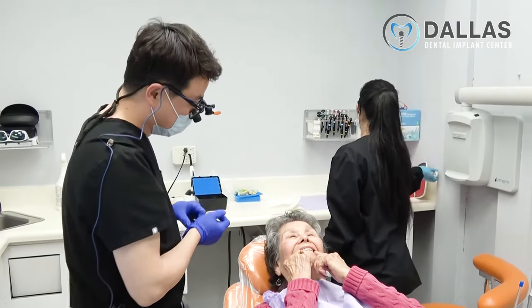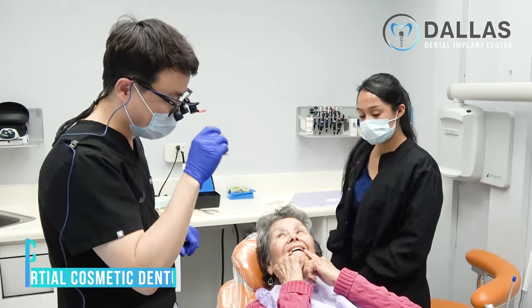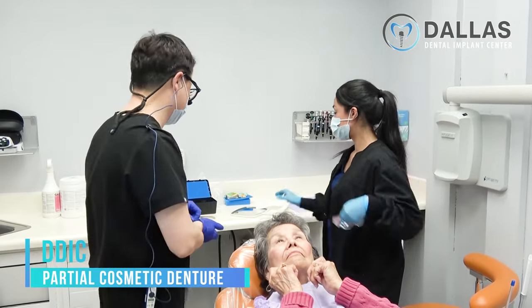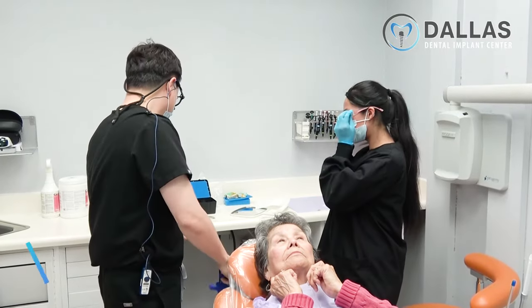Okay. Are you ready? This one has a little less retention. That's why it's easy. The metal clasp has better retention, so you need to practice it. Okay. Right, Crystal will help you.